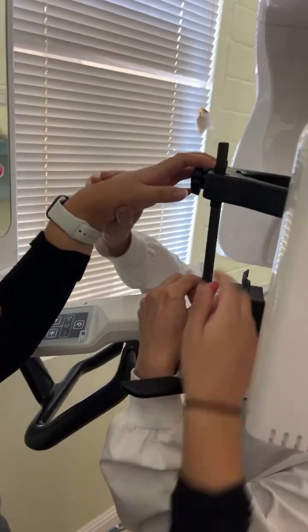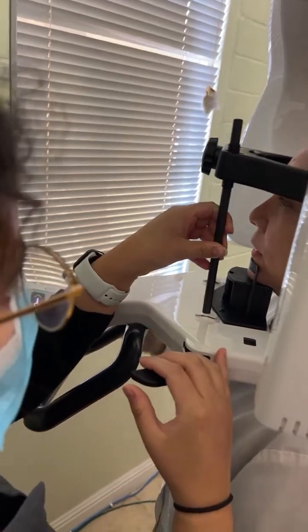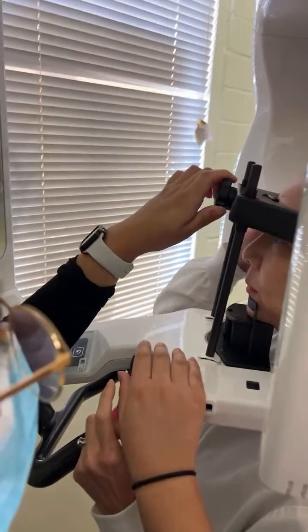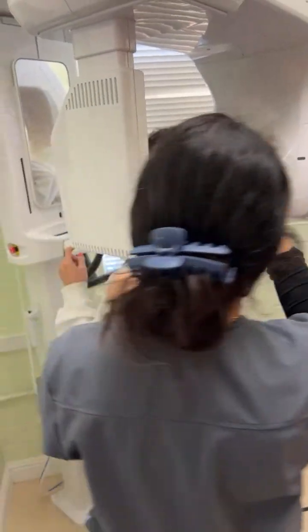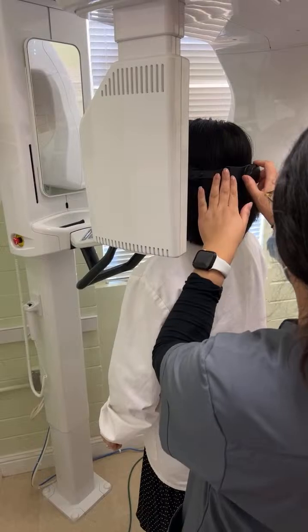So two hands. One hold right here. One hand here and one hand here. Release. And then put it here and lock it. And then tie it right here. Tie the back. Does anybody need a CT? Tie it. Not tight yet. Turn it that way. And then pull it down and tie it. Need to remove jewelry too. And then we'll release.